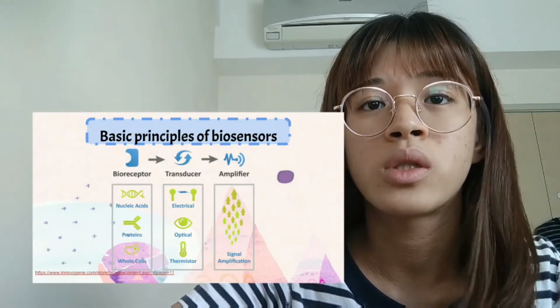Our group chose glucose biosensor because diabetes is becoming the most common endocrine disorder of carbohydrate metabolism. There are many tests used for the diagnosis and management of patients with diabetes. But because of the recommendation of maintaining a normal blood glucose level, a series of suitable glucose measuring devices have been developed. Glucose biosensors are one of the developed devices used to observe the concentration of glucose in patients.